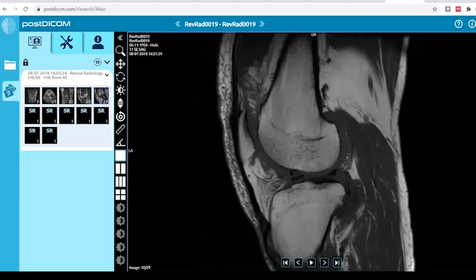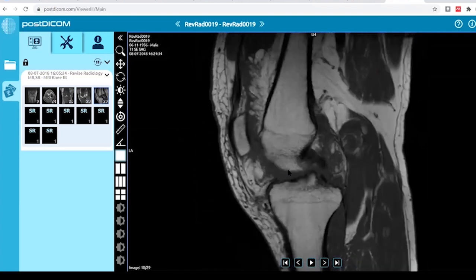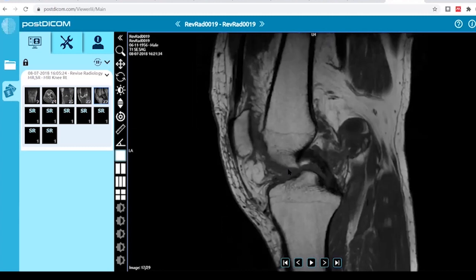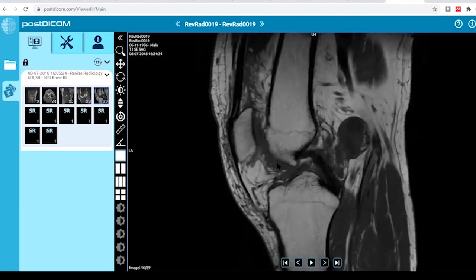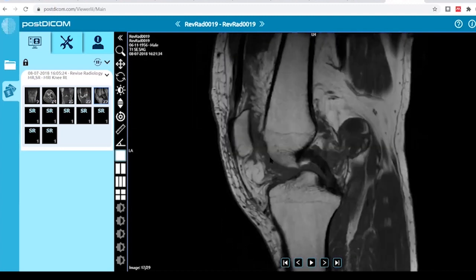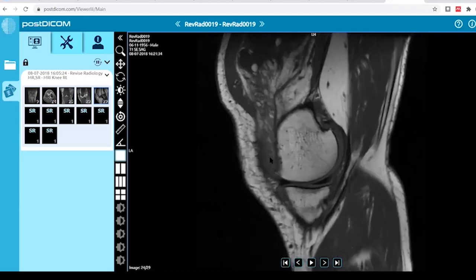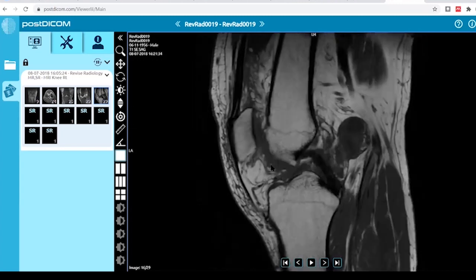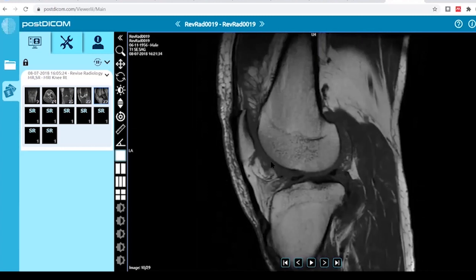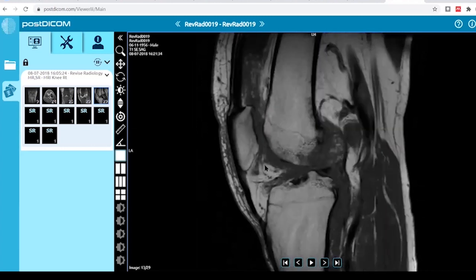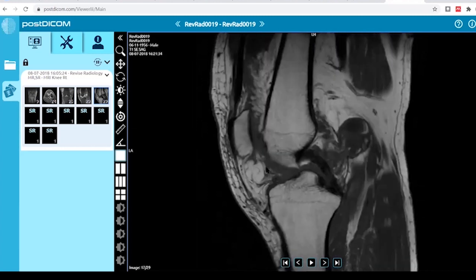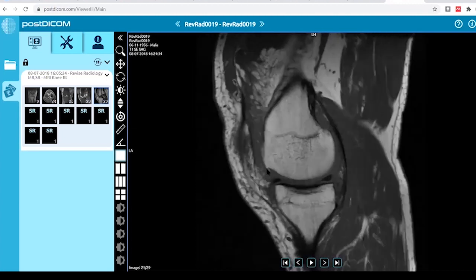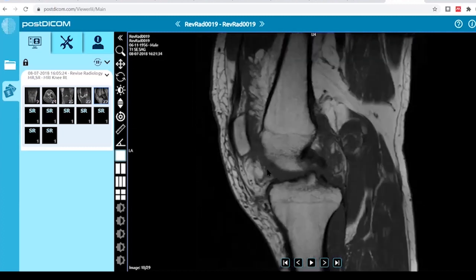With this finding, it may represent a complex knee joint effusion, or other differentials such as pigmented villonodular synovitis, synovial osteochondromatosis, or knee joint amyloidosis if the patient is a long-standing renal patient on dialysis. I will correlate the finding with a knee X-ray to see if there is any calcification. If there is calcification, it will most likely be synovial osteochondromatosis.